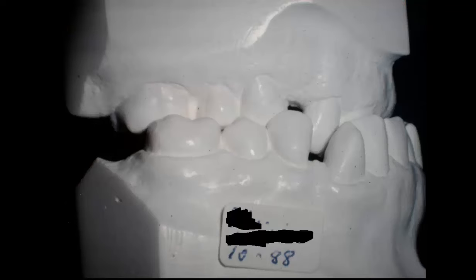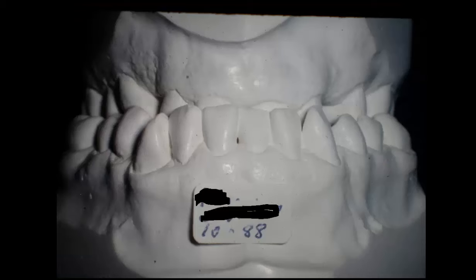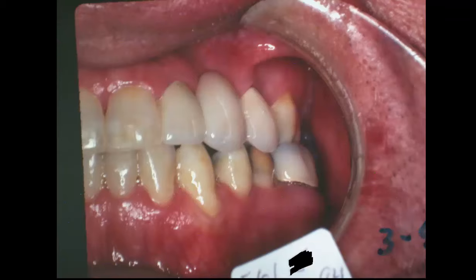Okay, there's the original block, I mean, his models, showing how deep it is. And there's where we went to after he had some bridge work to fill that in. And you see the open bite, the closed bite here, and how we opened it up and then bonded these. And I sent him back to his regular dentist, and he put bridge work in on it. And it's like that. Now we went to this.